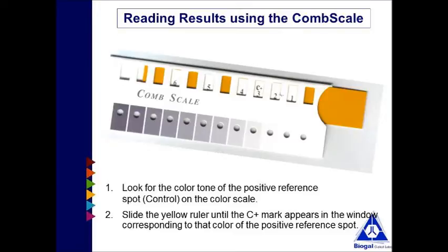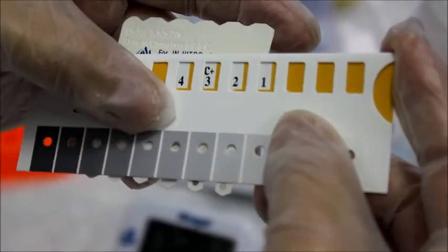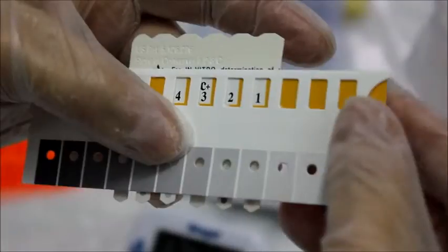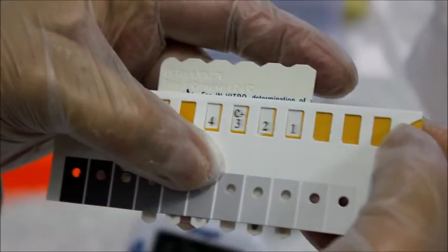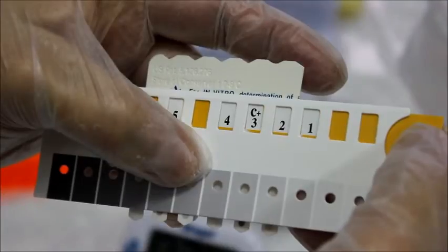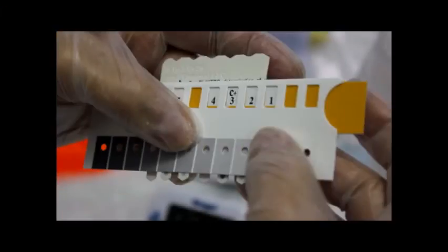Find the tone of purple gray on the comb scale that most closely matches the control spot on the upper spot of the comb, known as the positive reference spot. Slide the yellow ruler until the C+ mark appears in the window above the color you just found. Hold the ruler slide in this position during the entire reading and don't move it anymore.